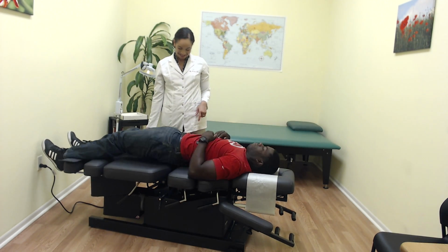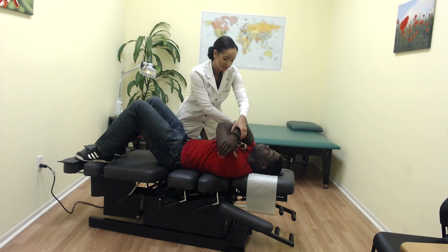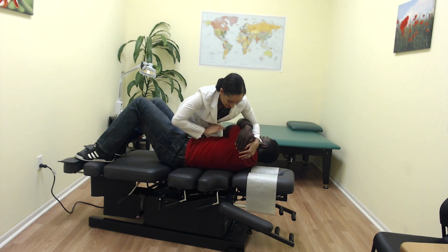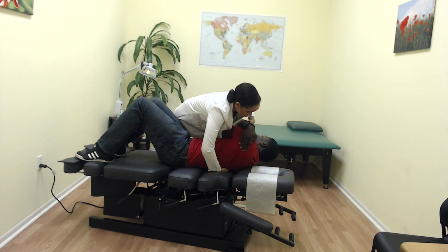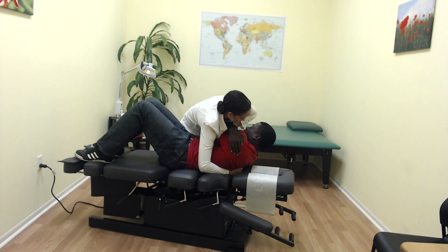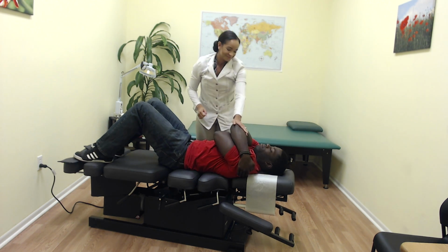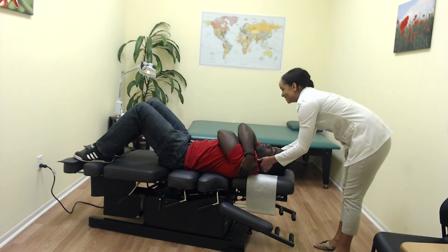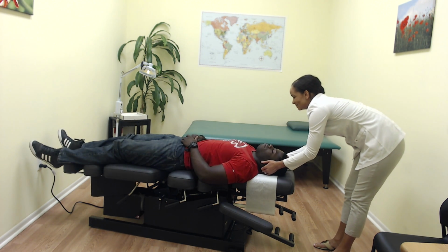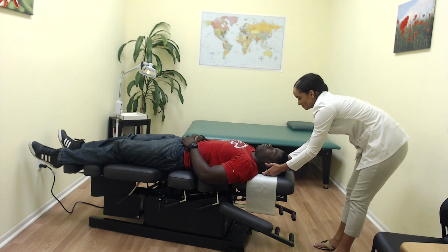Lay on your back. Good. And bend your knees up. Perfect. Last one. Give yourself a nice big hug. Hold tight. There we go. All right, tuck your chin to your chest. Good. And relax all the way down. One more time, all the way down. Just let it go. Let it relax. All right, you can relax to where you're comfortable.